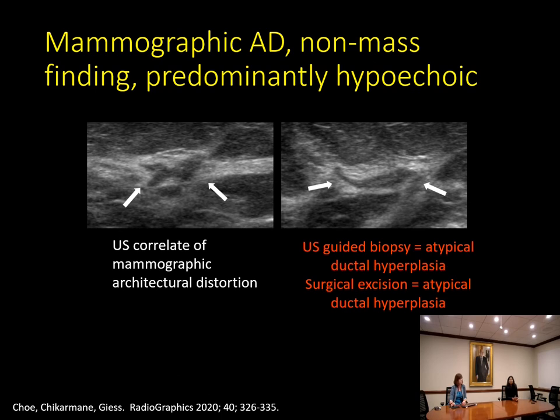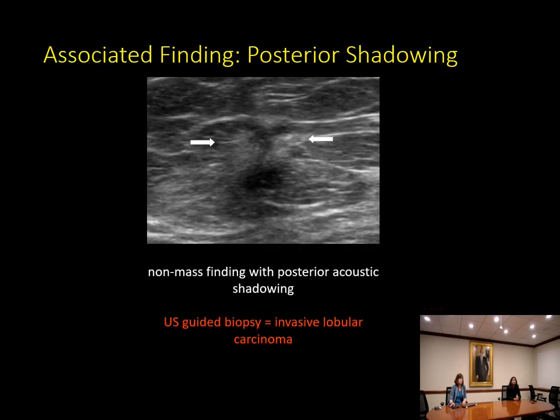It's really important to see non-mass findings on two orthogonal planes to confirm a real finding, because on one image it can look like surrounding tissue. Posterior acoustic shadowing as an associated finding can also help the radiologist pick up these sometimes subtle findings. In this example, the non-mass finding has shadowing that first catches the eye, but it's important to recognize the accompanying altered echotexture as well — a hyperechoic rim with a more hypoechoic area anteriorly. This was an invasive lobular cancer, a fairly common histopathology for malignant non-mass findings.